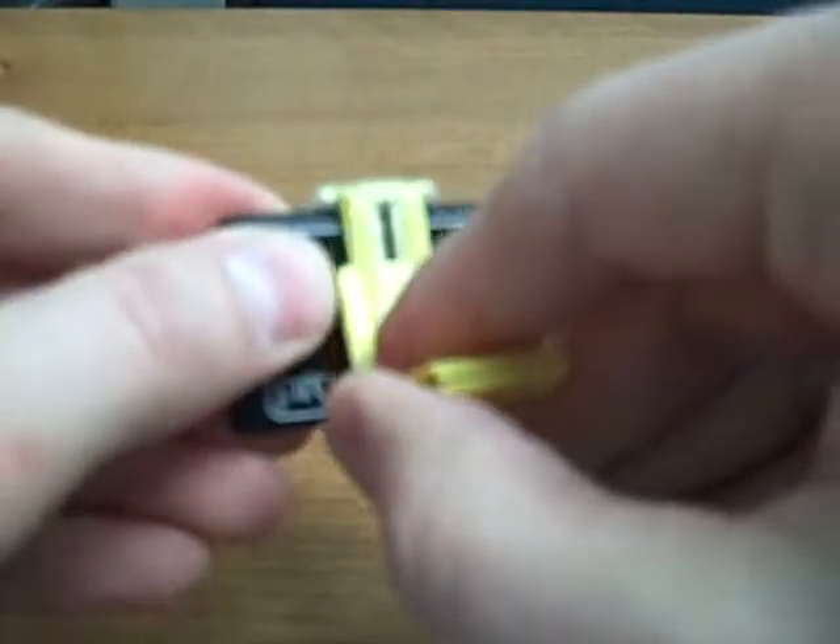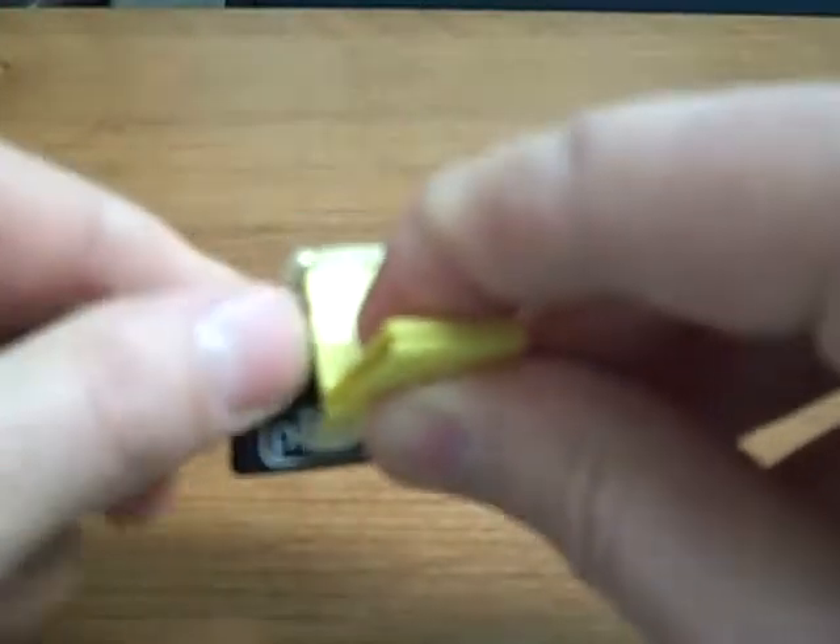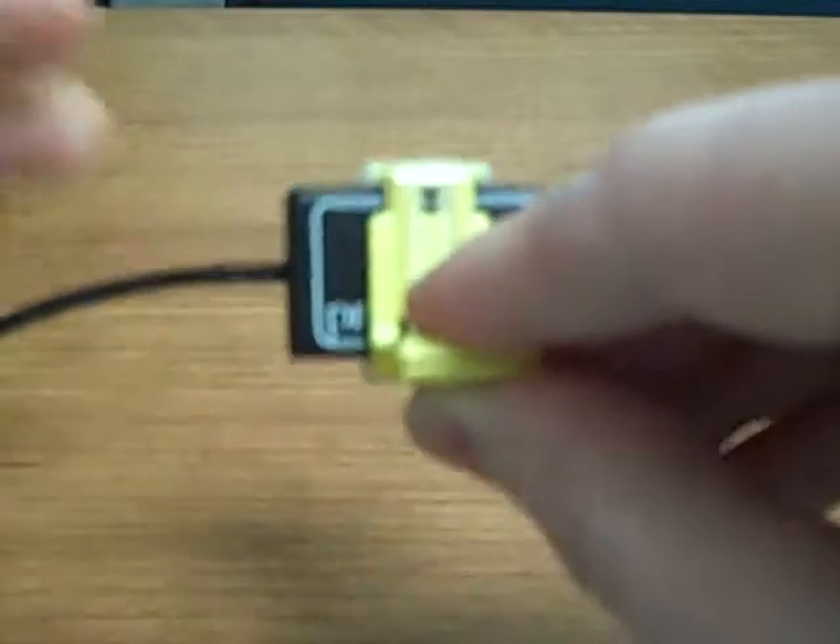And a posterior. The yellow holder is for posterior indications, so it's going to be holding your sensors in the horizontal fashion. There it is with the size 2, and here it is with the smaller size 1 sensor.